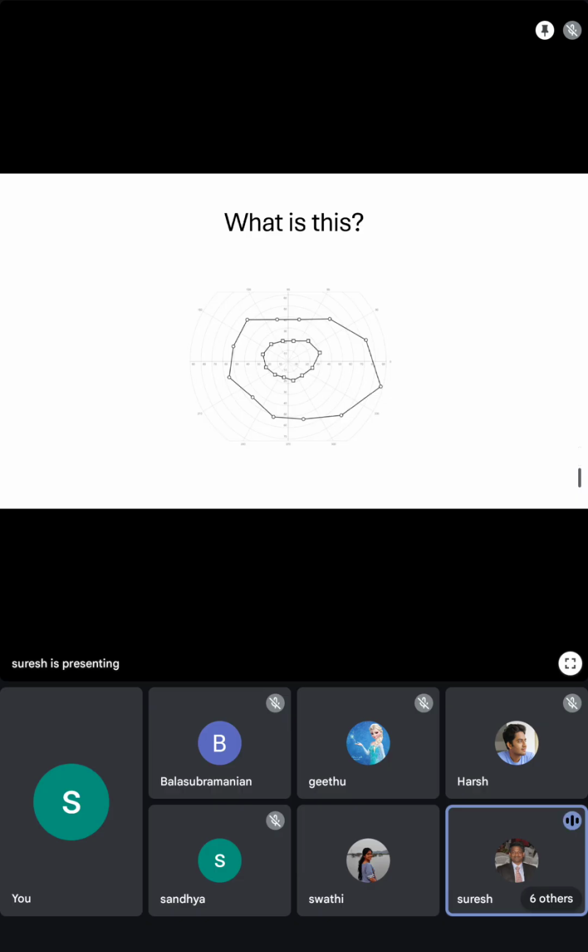This is a kinetic perimetry. Madam told you, no? I saw her, she was telling so many things. This is a kinetic perimetry. But what is special about this? Can a kinetic perimetry be done with a Humphrey?